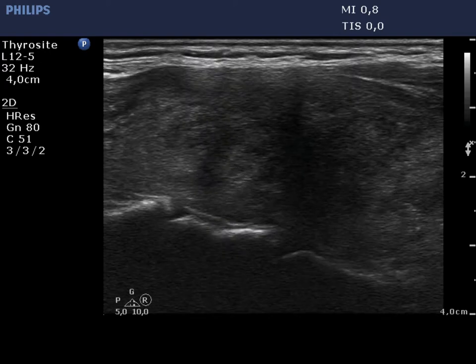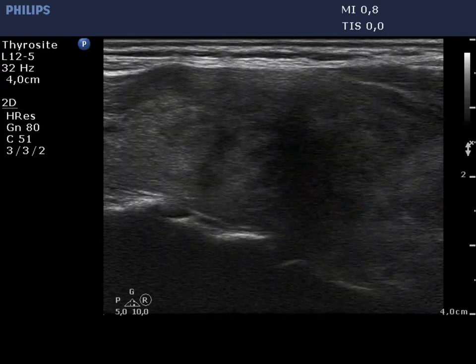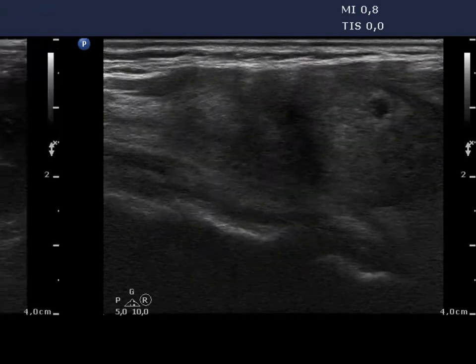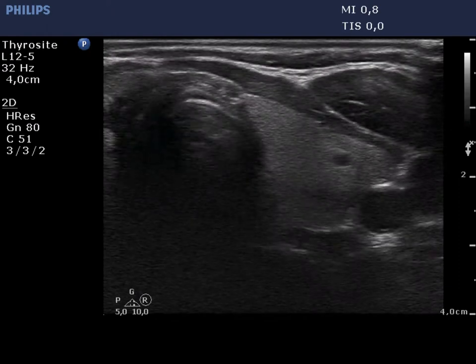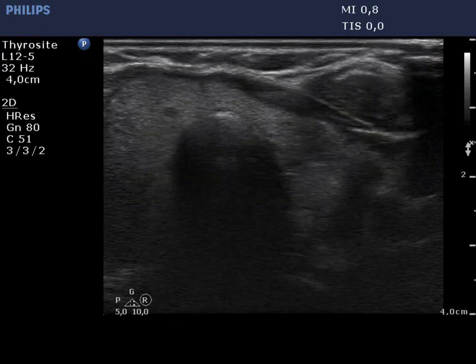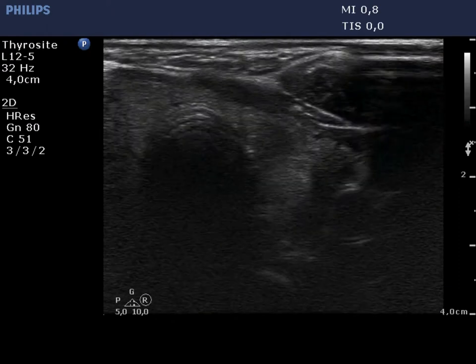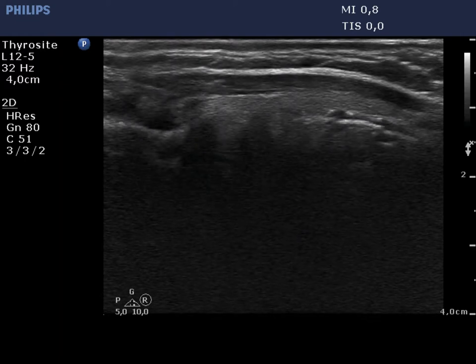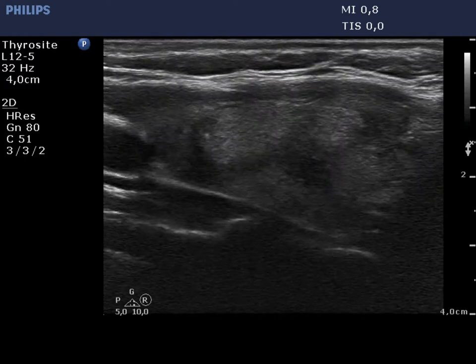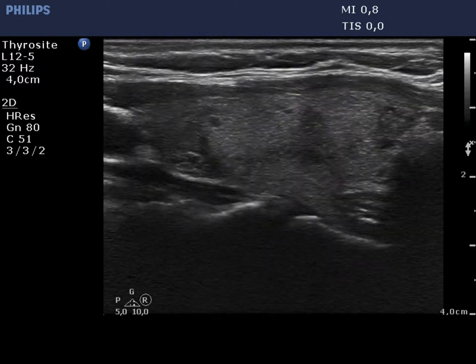The echogenicity index is around 80% in the right lobe. The left lobe has a similar appearance, but the echogenicity index is much less.